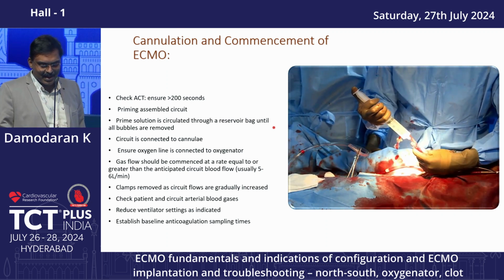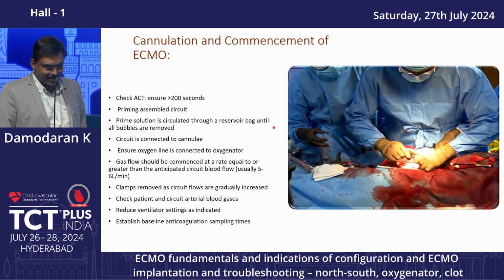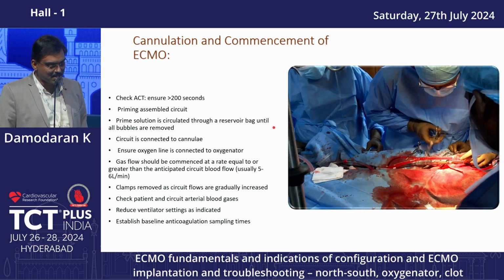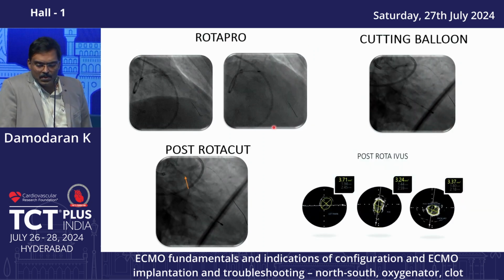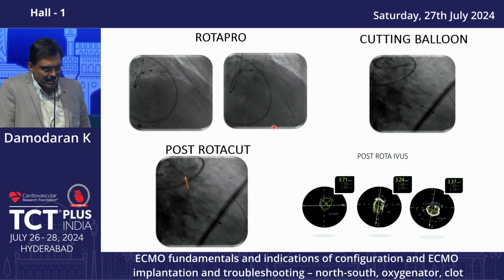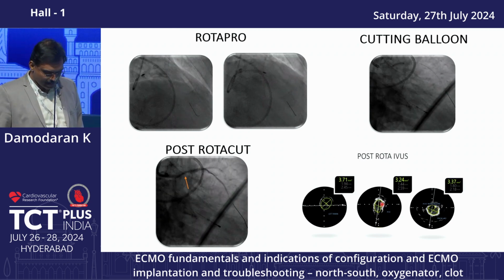You can see that one Y connector. We thought, let us try with a single access like in, what do you call that, in Impella. But unfortunately, in our country, we don't have the adapter, so we cannot do that. We have gone with the other access, just for interest only, nothing else. The other side was okay. Then we went ahead with the Rotapro and then cutting balloon. You can see that the cutting balloon has cut the middle LAD and even the left main, whereas in the ostioproximal LAD, there was a nodule. You can see from the IVUS, there was a nodule there.